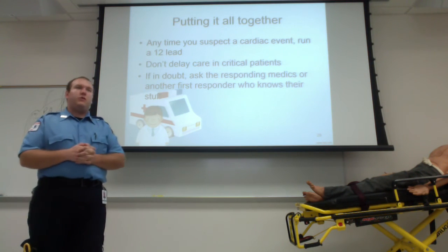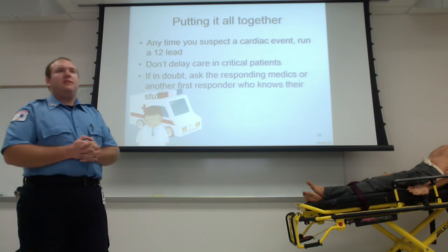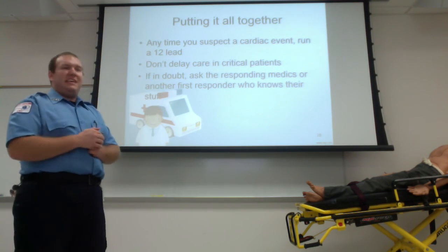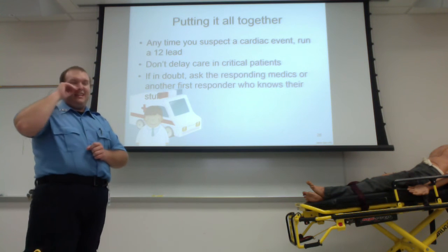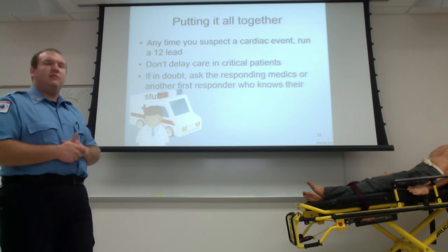I think he had something going on with his heart. I went ahead and ran a 12 lead so that way the paramedic crew can look at it, and that way we have one initially right when we get on scene. If he doesn't need it, hey, no big deal. Stickers don't cost that much that you can't use a little bit of money on this patient here. However, if he is having something going on, hey, great. We are able to catch it a little bit earlier.